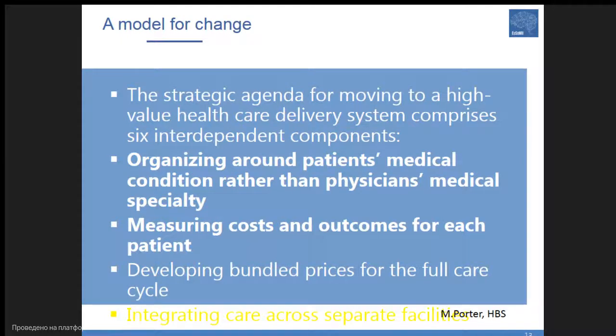So it means that all clinical workflows should be integrated for a separate medical condition. It's important to measure costs and outcomes for each patient, and integrating care across separate facilities is facilitated by information systems and also by PACS.